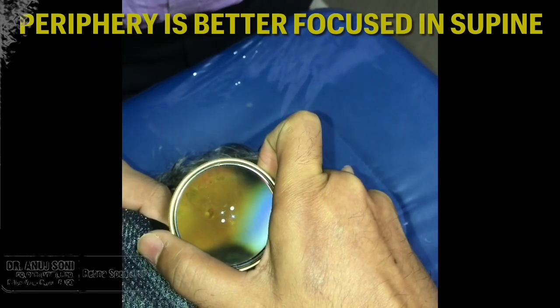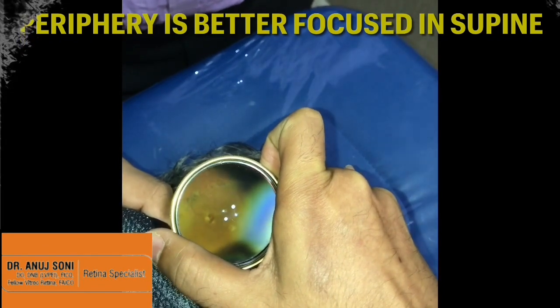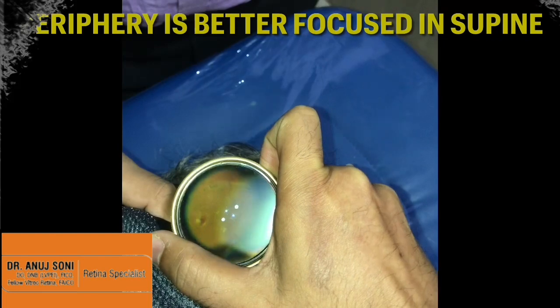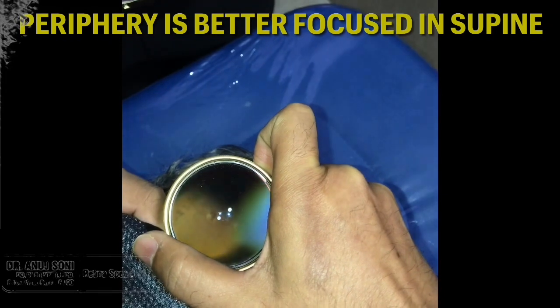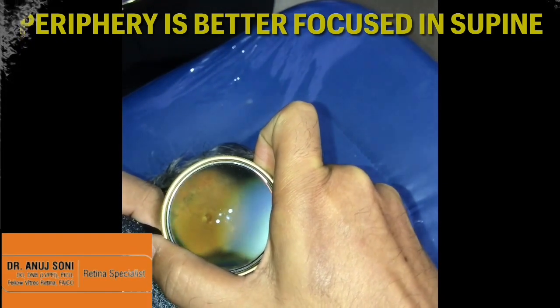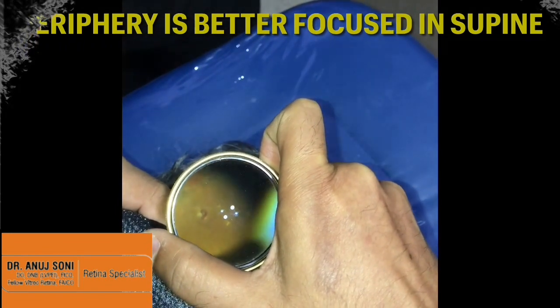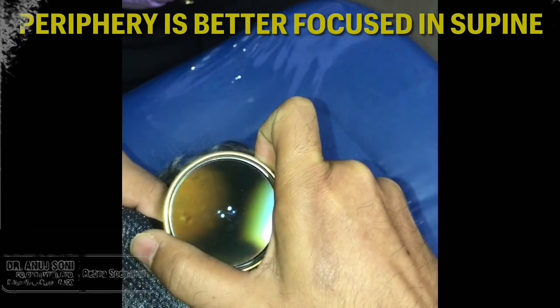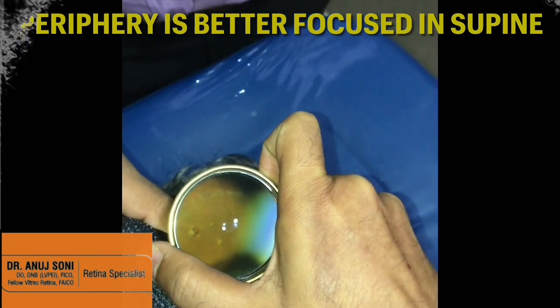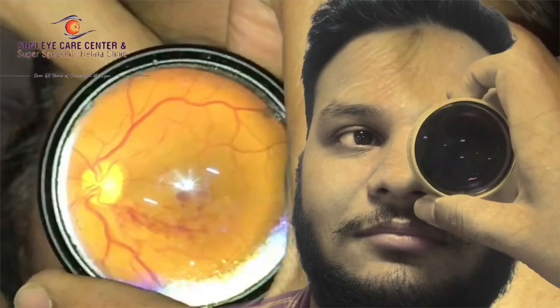A small HST is visible if you see carefully. Remember, practice makes perfect, but some patients may try to put your morale down.